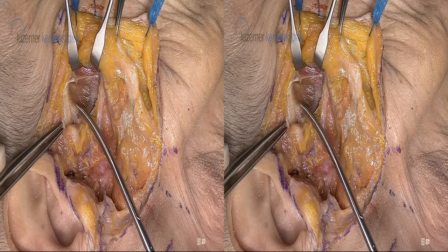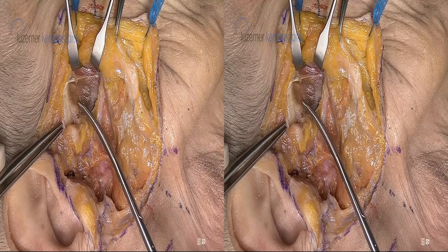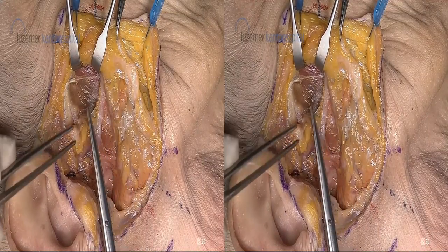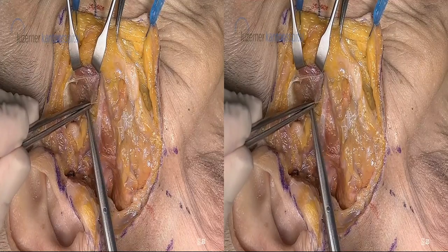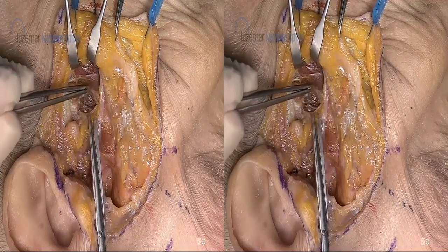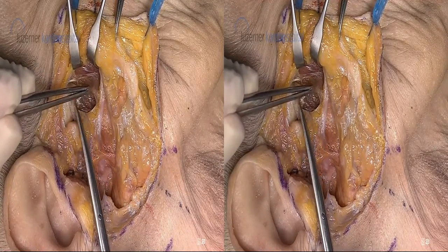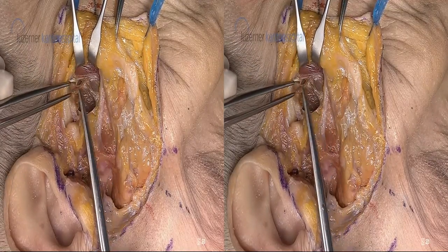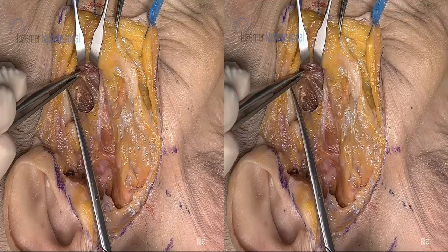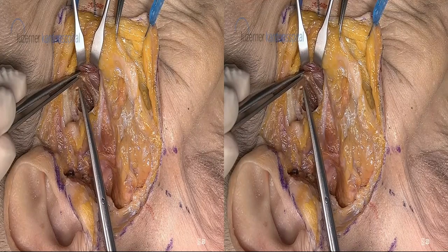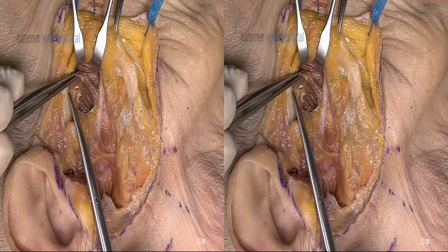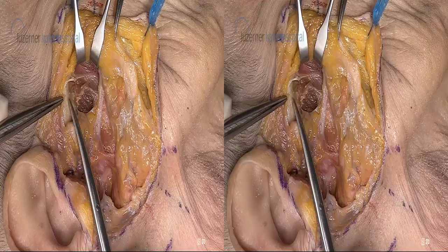Now in a clinical patient, there will be motor innervation for the masseteric nerve, so you could use the stimulator — I prefer the monopolar stimulator — just to localize where approximately you can expect the nerve. Or in case you're not sure if this is the nerve, you can use the bipolar stimulator to find the nerve. The nerve is in the muscle itself, so we may come from posteriorly and get into the muscle layer by layer. Since we are disconnecting the innervation anyhow, the muscle will not be pulling anymore, so we can take part of the muscle. Be aware that here and superiorly, along the root of the zygoma, you have fibrous attachment of the muscle towards the zygoma, which can mimic — from the color — the nerve itself. But it's not the nerve, it's just fibrous attachment.